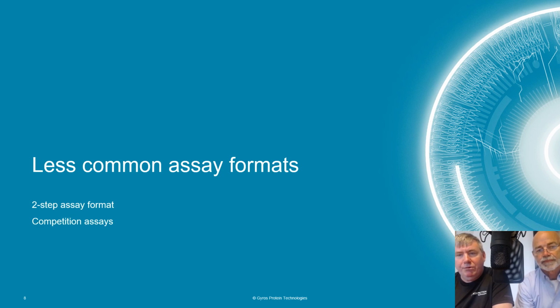So now we want to focus on some less common assay formats and some of the unique challenges associated with them. We want to look at the two-step assay format where you pre-incubate the capture and the analyte, and that seems to be quite effective for quite a few assays. And also competition assays, which we've done quite a few of over the last couple of years. So I want to give you some tips on competition assays.